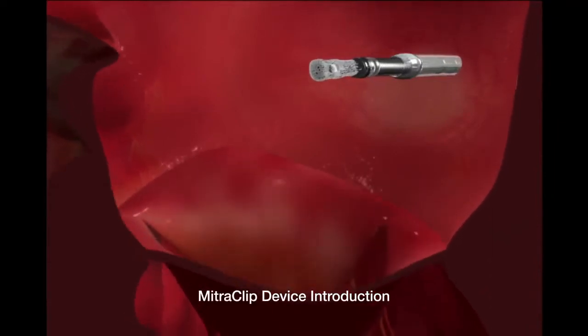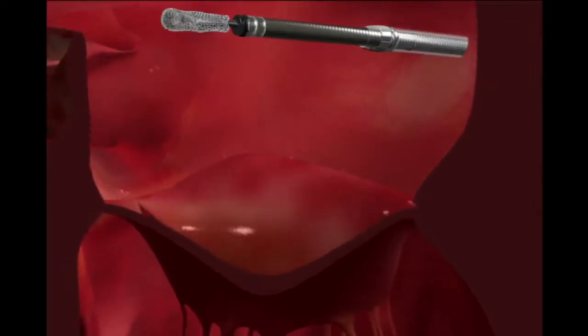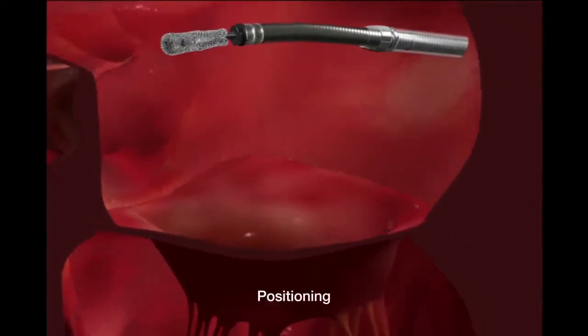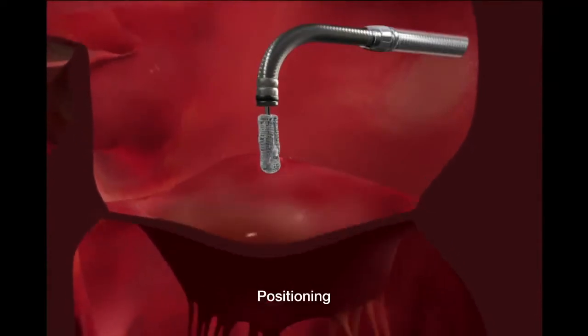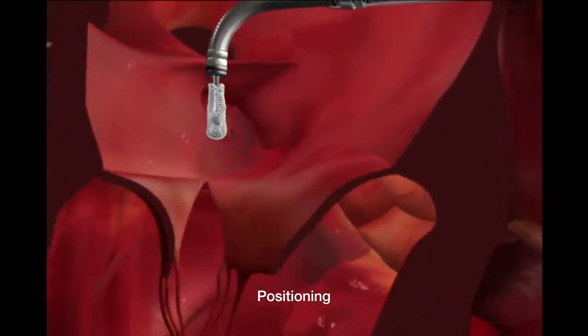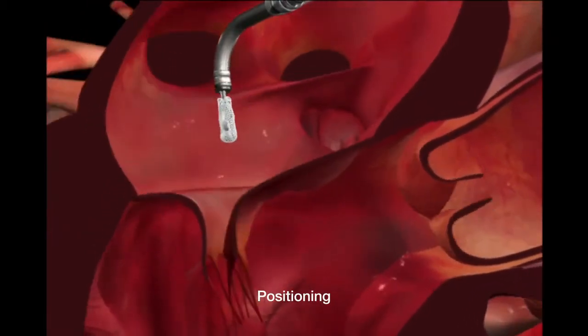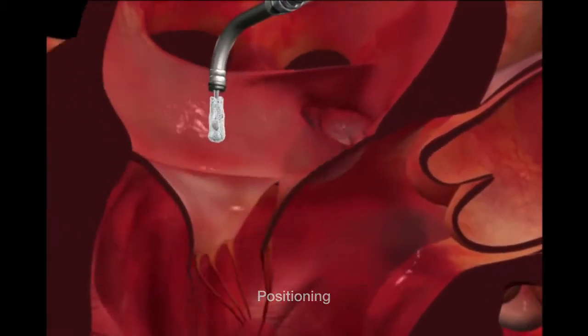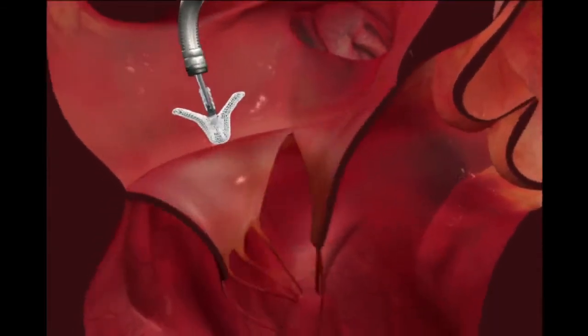The clip is gradually introduced into the left atrium. The clip is precisely positioned above the leak in the valve. The clip arms are opened in the left atrium for final positioning.